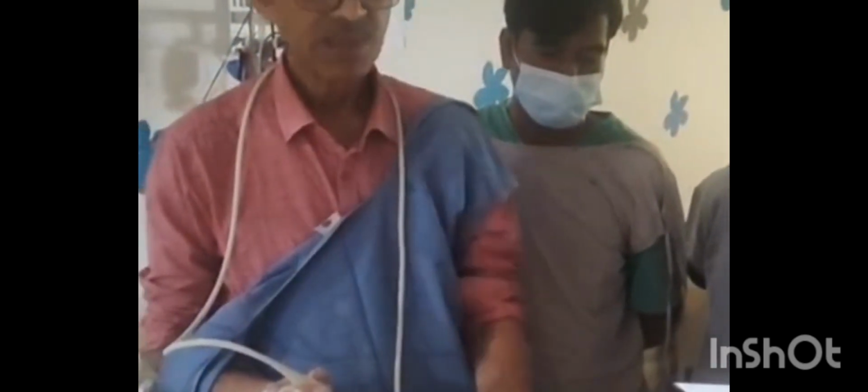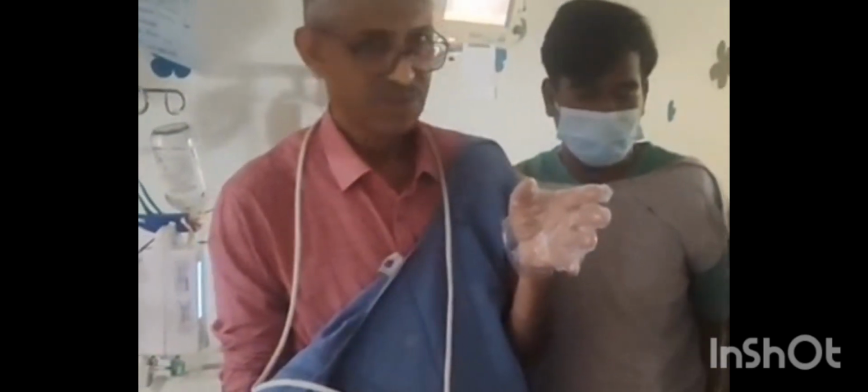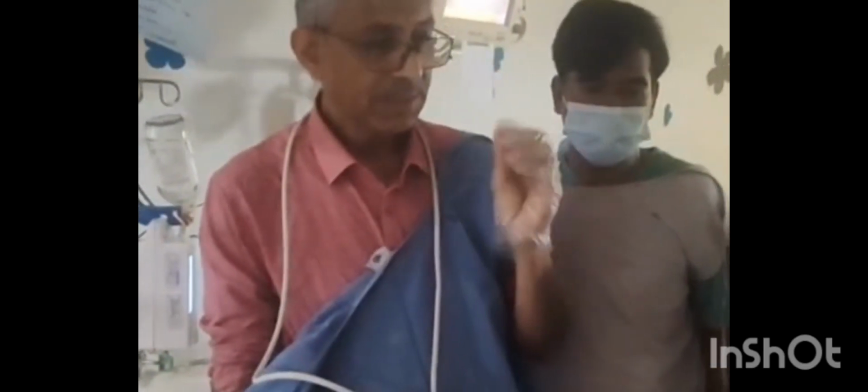So that means both the right coronary artery and the left coronary arteries are dilated, but more on the left side. That indicates this coronary artery is dilated, and you can see they are dilated towards aneurysm also. Correct?